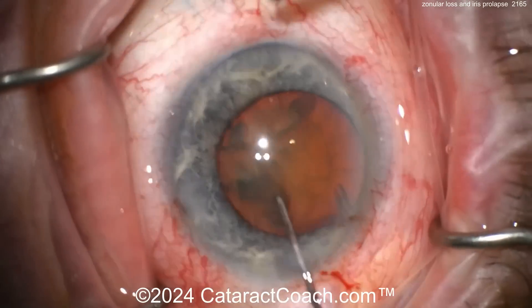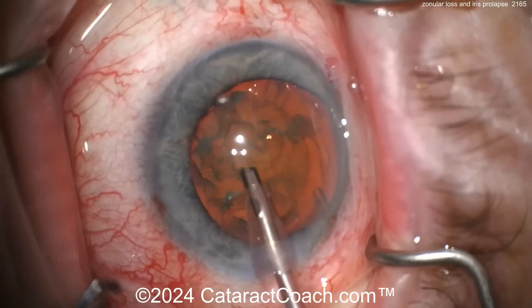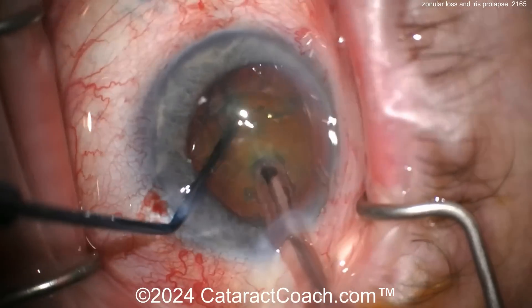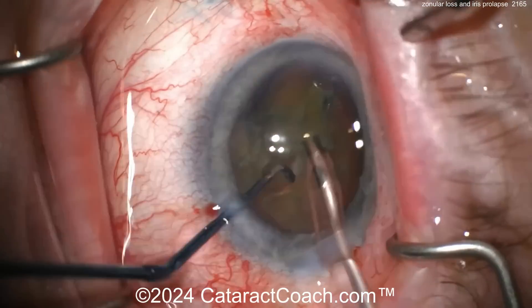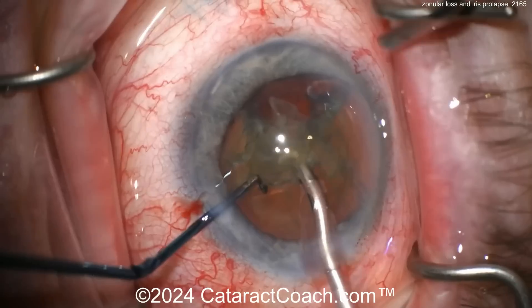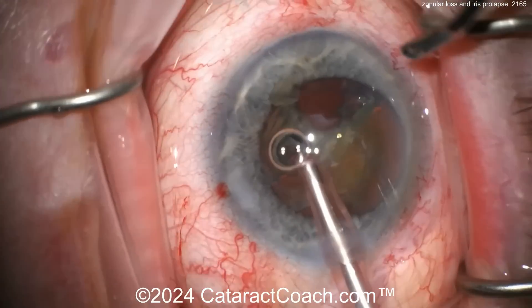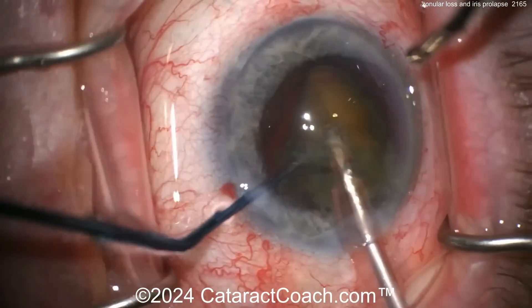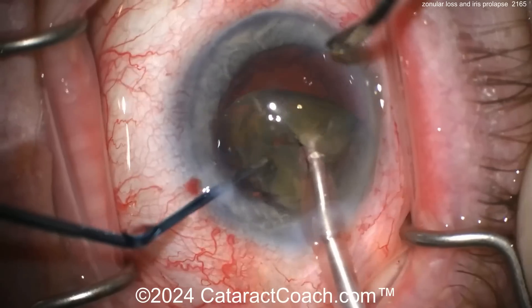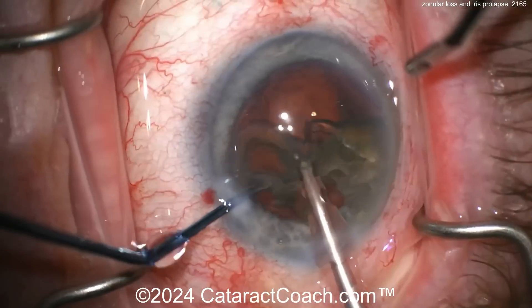A little hydrodissection with a cannula, rotate a little bit. Here comes the phaco probe. The technique looks like a horizontal chop — there we go, rotate, another chop. Very efficient surgery. But just remember, every surgery is just another opportunity to have a complication, a challenge, and stress on your life. Only joking, but we both know it's true.